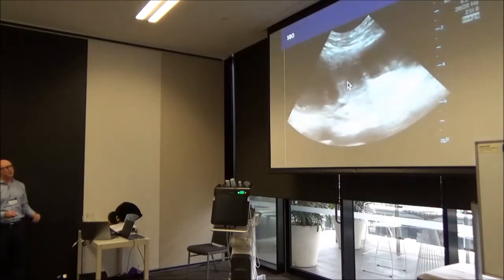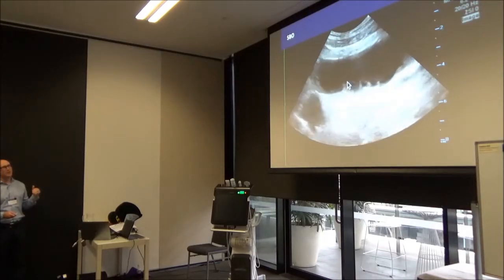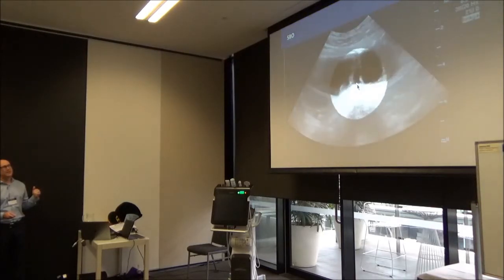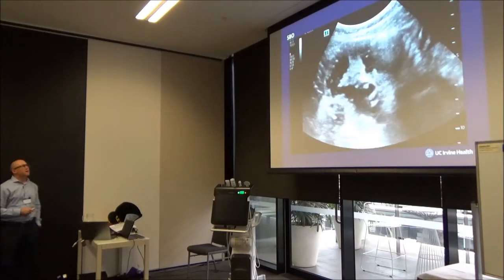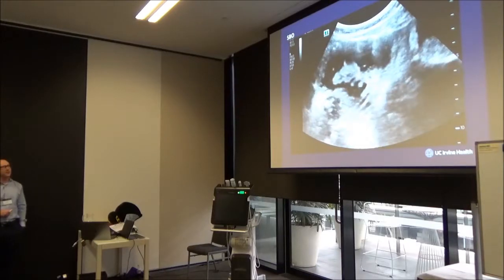They call this the keyboard sign. When you get mid-position on a small bowel, you'll see these little plicae down here. Some people call that the keyboard. They're like little keys on a keyboard to some people. Some more poo and fro for you here.